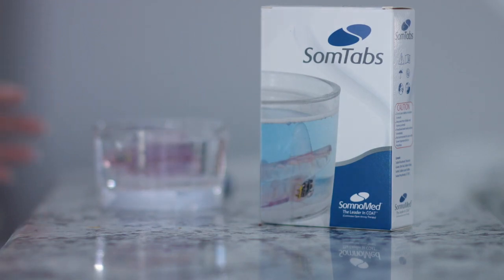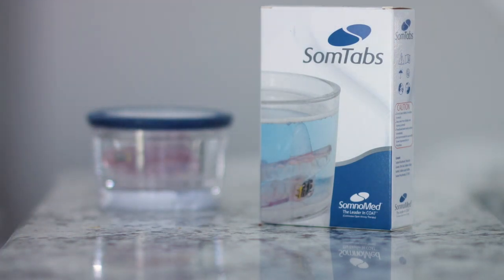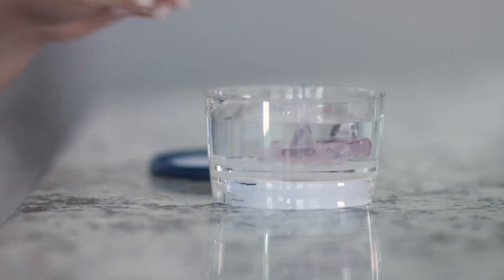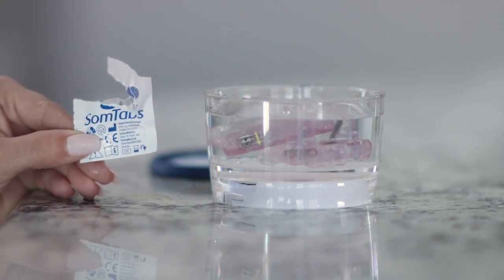We recommend Somtabs for the gentle and thorough cleaning of Somnodent devices. Every morning after removing your device, rinse it under running water, then place it in your Somnomed retainer with water and add a Somtab.